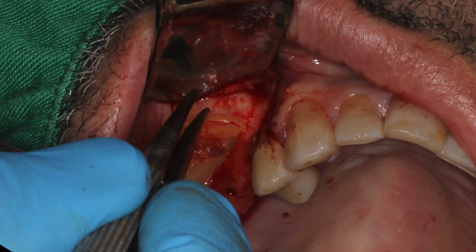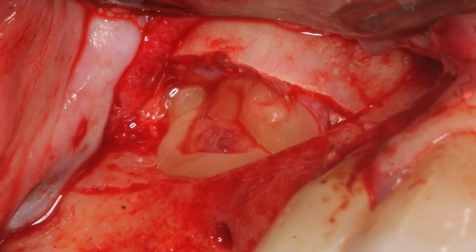And of course, this is a slimy material, so as soon as you put that into the sinus cavity, it will move around. If there is a tear of some sort, that will tend to disappear and possibly end up on the other side of the sinus through the tear. So we do have to be quite careful at this point.